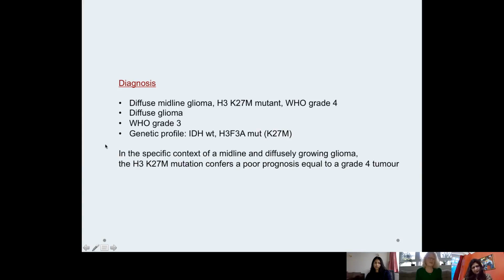So the diagnosis here is, histologically, a diffuse glioma, probably astrocytoma, but I didn't confirm with immunohistochemistry. The grade is grade 3, as I said before. Finding a few mitoses in a small biopsy is not compatible with a diagnosis of a low-grade glioma. But because of the presence of this defining mutation, the final integrated diagnosis here is diffuse midline glioma, WHO grade 4.